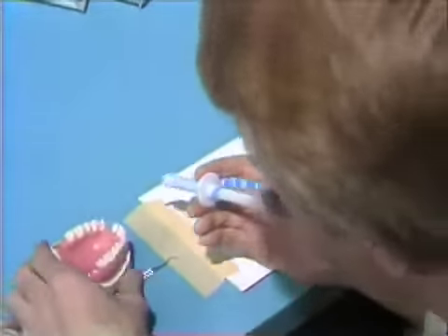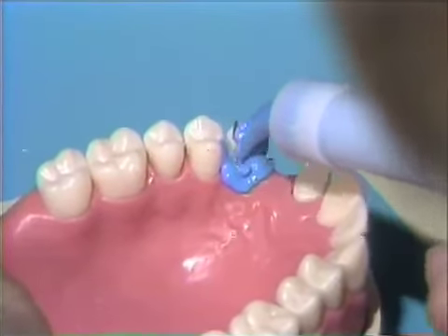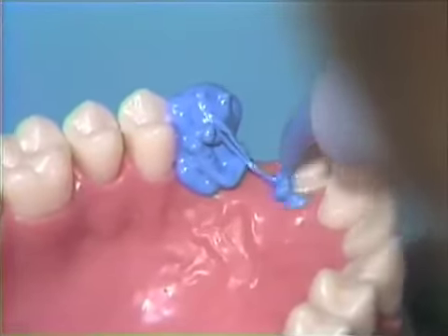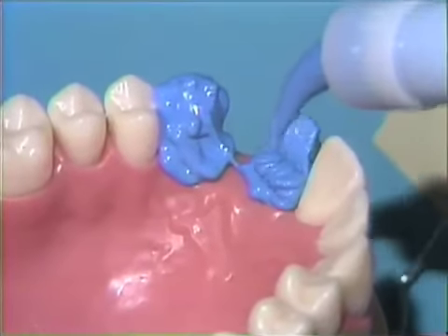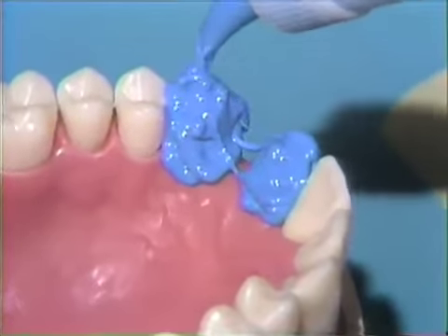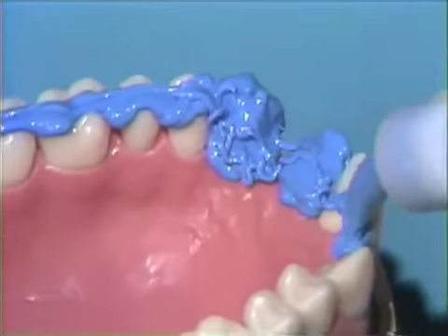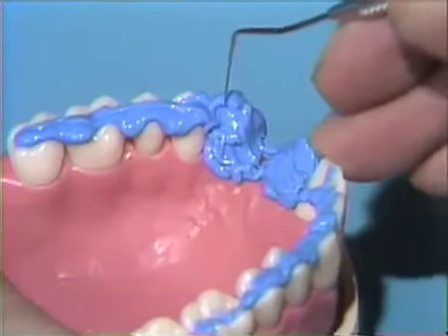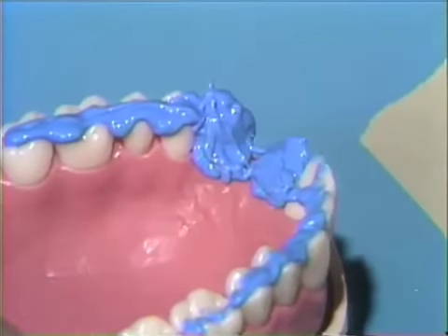We're now ready to load our syringe and place the plunger in the end. We'll go over and start syringing initially down in the sulcus area, work our way all the way around into the boxes and grooves, up over the incisal edge, and come over to the porcelain fused to metal restoration and work around it completely at the sulcus area, completely covering this preparation. We can also cover the occlusal surfaces and the lingual surfaces if we have extra left over. Before seating the tray, we will lightly touch on the tip of each of these little pins to make sure they are fully seated into the impression material. We're now ready to seat our heavy body tray.